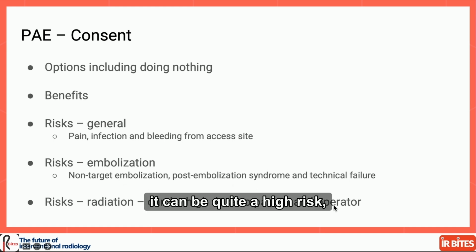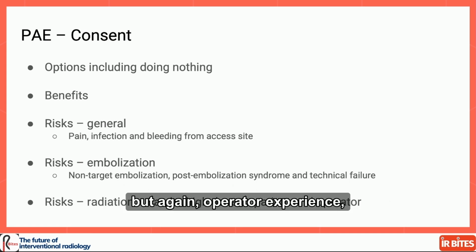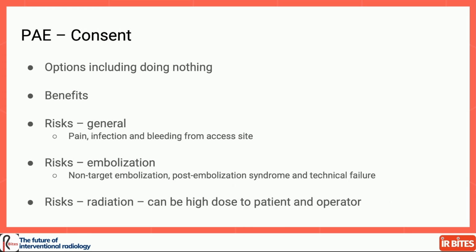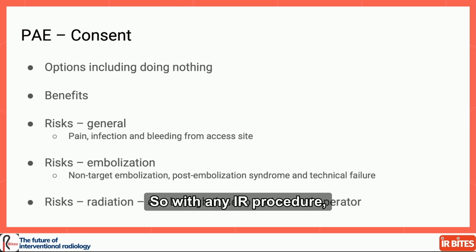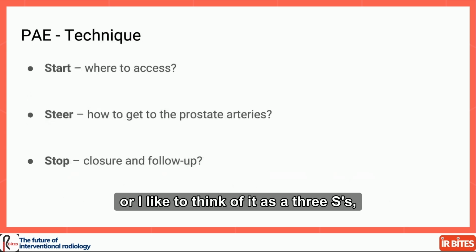It can be a high dose procedure relatively compared to other procedures, but again, as operator experience grows, times reduce, and access and planning improve, those risks come down quite significantly. So technique. With any IR procedure, I like to think of it as the 3 S's, and that's how I see it myself, is how we're going to start.